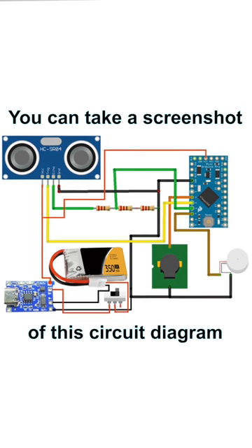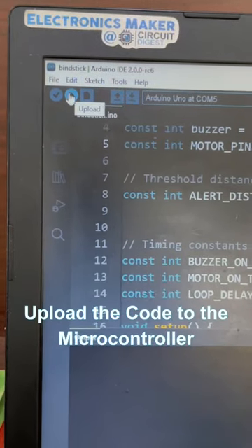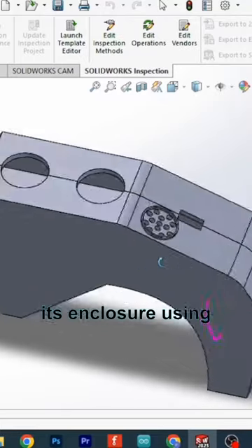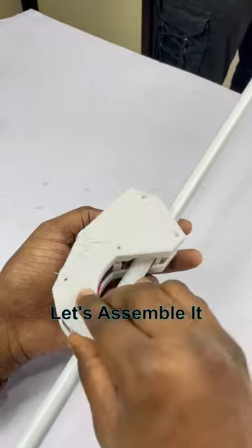You can take a screenshot of this circuit diagram to recreate this project yourself. Upload the code to the microcontroller. The final step is to design its enclosure using SOLIDWORKS and then 3D print it. Now let's assemble it and test it.